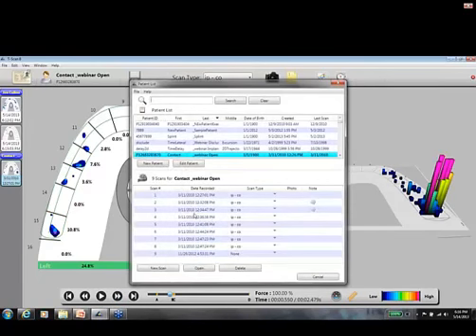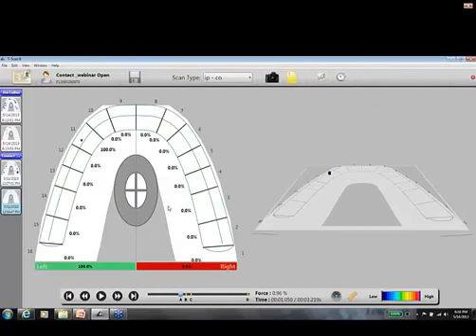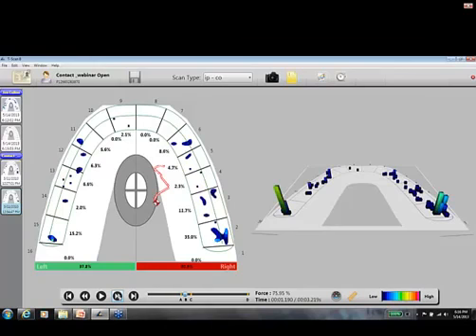We made some adjustments on number 2 and number 15. I didn't, obviously; the doctor did. So let's look at 1234. Okay, so I'm going to play through again. Now the patient comes in, and it's looking better, right? We have 35% of force now, not 60-something%, and we're 60-40. So we're getting there. Again, it's the same process.